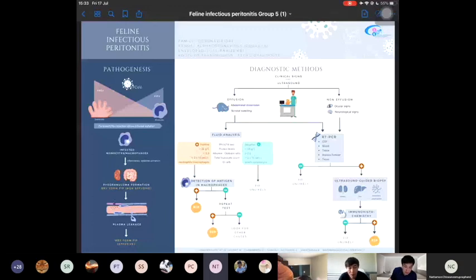Coming back to the previous question, do you have an answer now about the strip test? I think the strip test can give false positives, mostly false positives and less so false negatives, because most cats have experienced FCoV or coronavirus, but it doesn't need to be FIP. So most of them can give a false positive result. Are you sure?